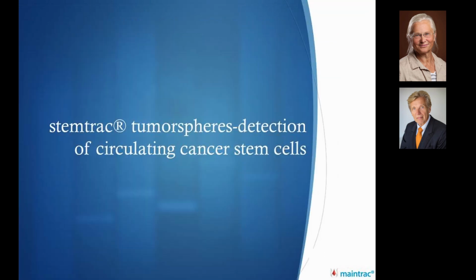An additional test which we can perform on the circulating cells is StemTrac. With this approach, we grow only those cells which have a potential to divide, and these are called circulating cancer stem cells.